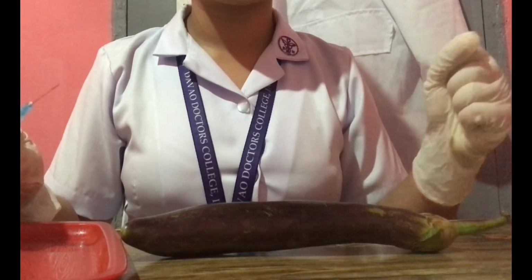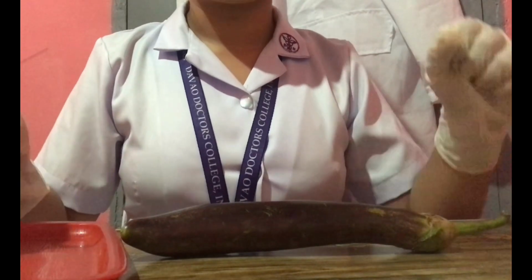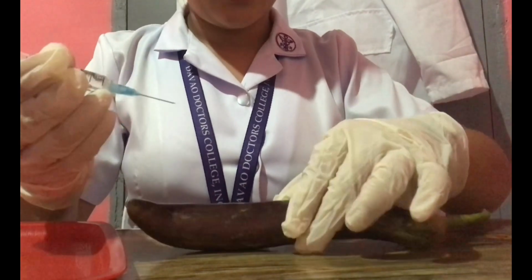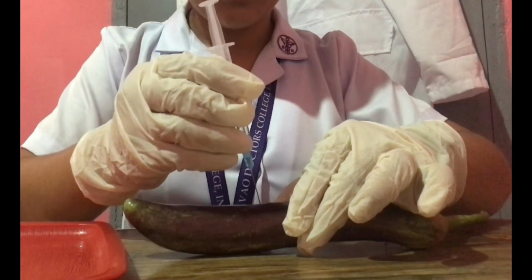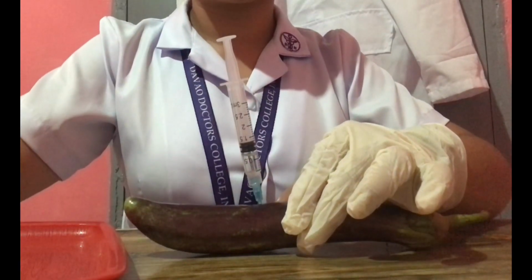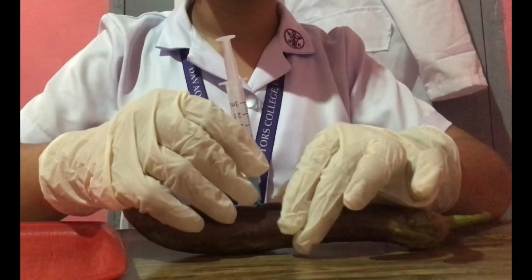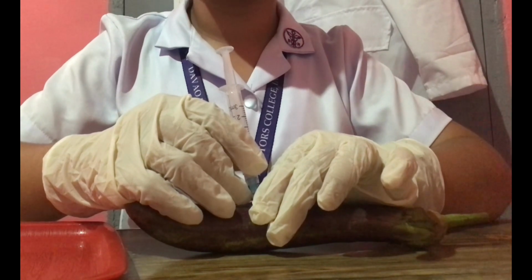So inject the medication using the Z-track technique. Now we're going to inject the medication. Okay, inject the medication.